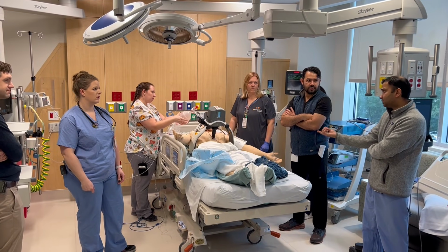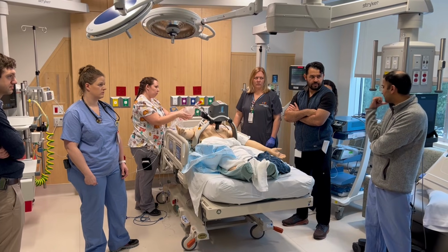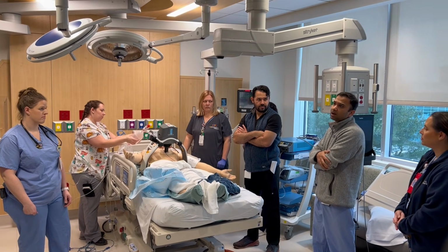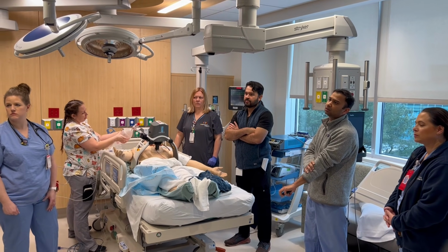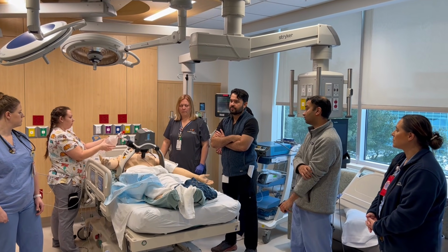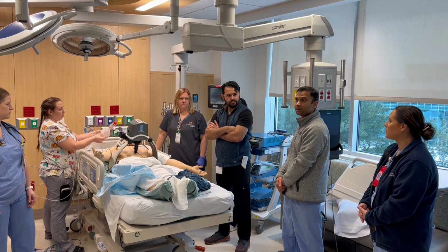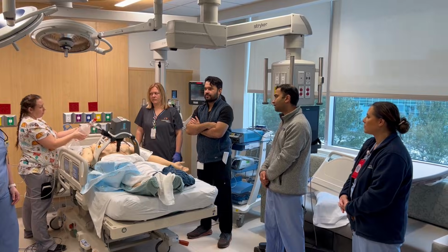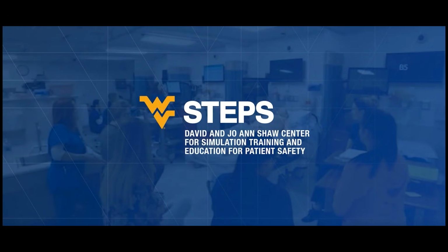You have a PEA, so you should go on ECMO. He's 14 years old. We can look at the ultrasound to see if the vessels are adequate. What size drainage cannula do we need for this patient? It would be a 15 and a 23. Okay, and get the percutaneous dilator case ready. We'll just take a look at the drainage. It seems like a percutaneous VA approach for the drainage. All right, you guys open the equipment and we'll get ready.